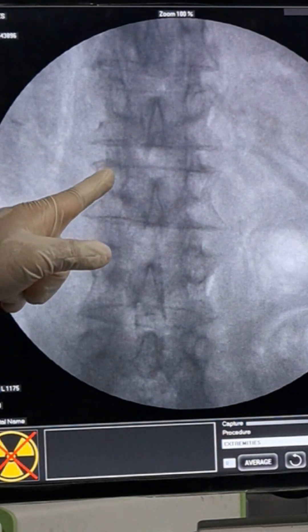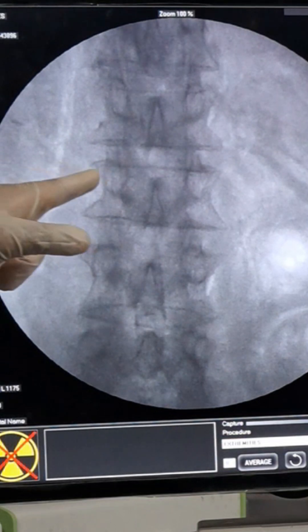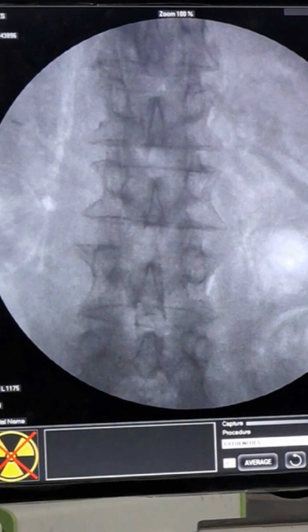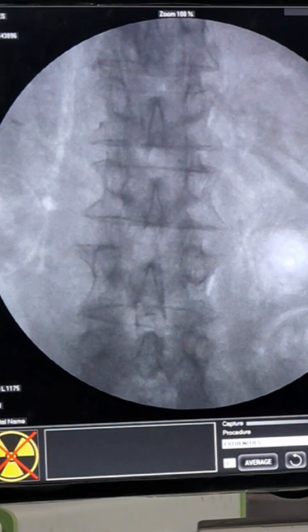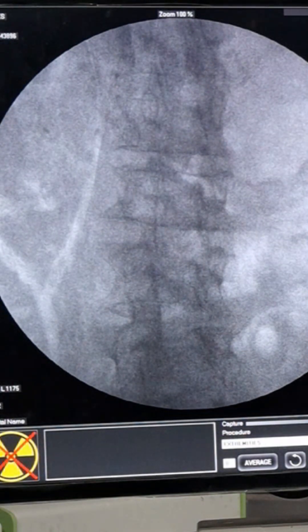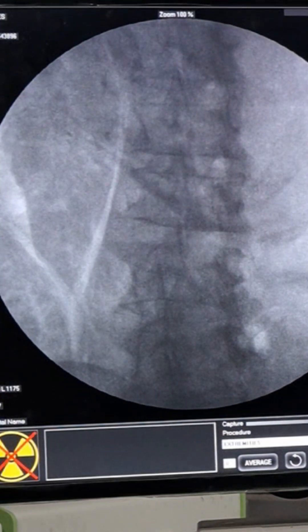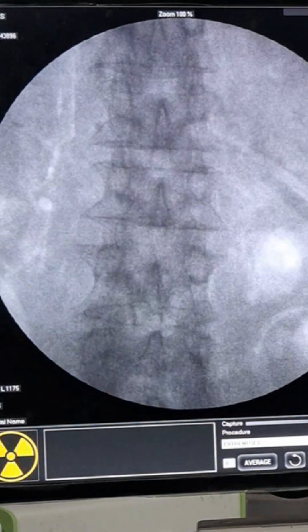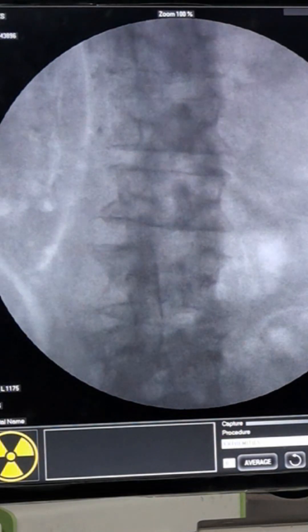Once the pedicle is visible, you can identify the transverse process. Now I will take the C-arm oblique to where the outer border of the transverse touches the outer border of the vertebra. If you cannot see the transverse process properly, you can use continuous fluoroscopy — that allows better visualization than intermittent imaging, though it does increase radiation exposure.